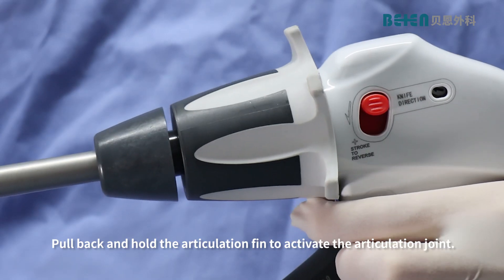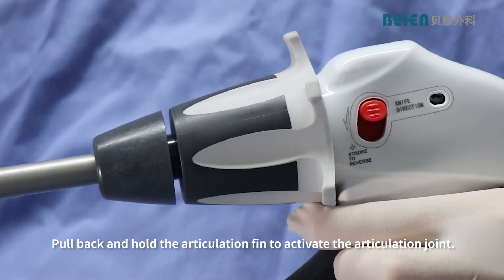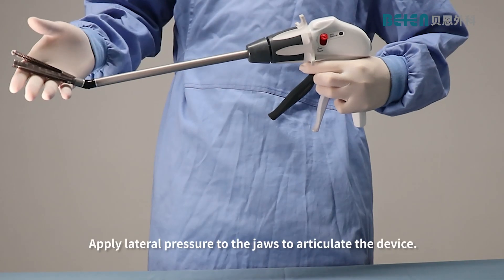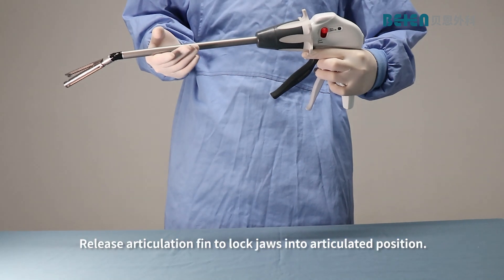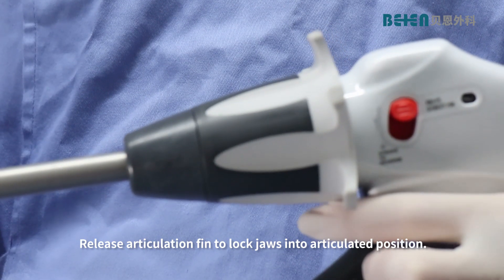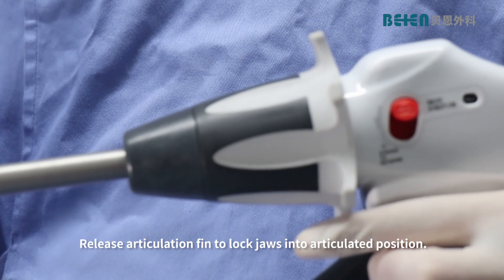Pull back and hold the articulation fin to activate the articulation joint. Apply lateral pressure to the jaws to articulate the device. Release the articulation fin to lock the jaws into the articulated position.